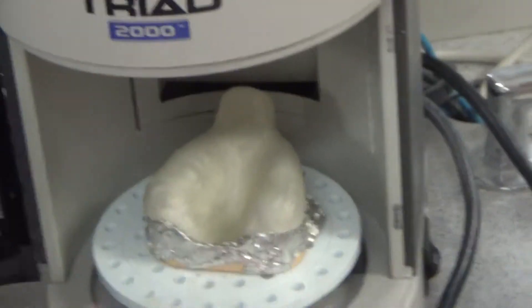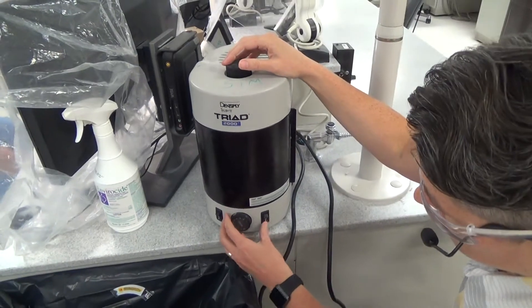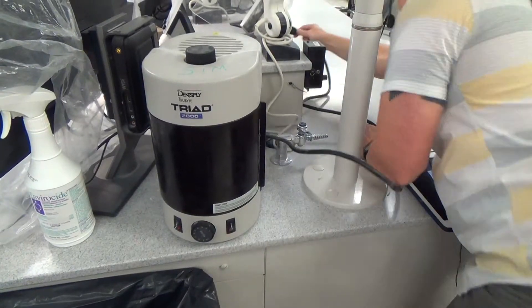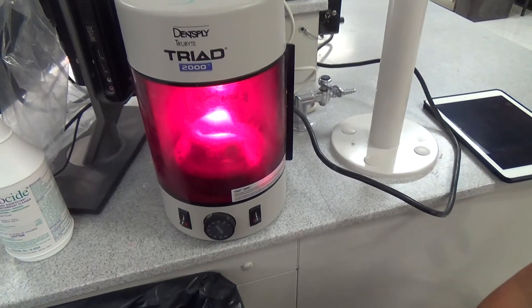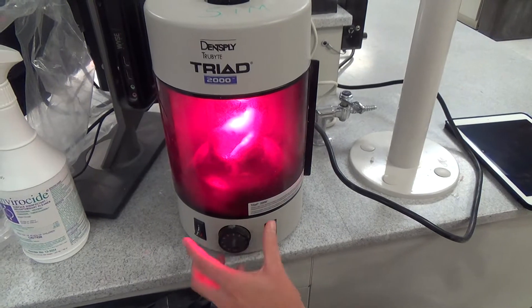I'm going to adjust this tray so that it's at a good height. Maybe this one's not plugged in — it's not plugged in. That helps. So I'm going to let it go for about 15-20 seconds for this initial cure. I put it on 4 minutes.